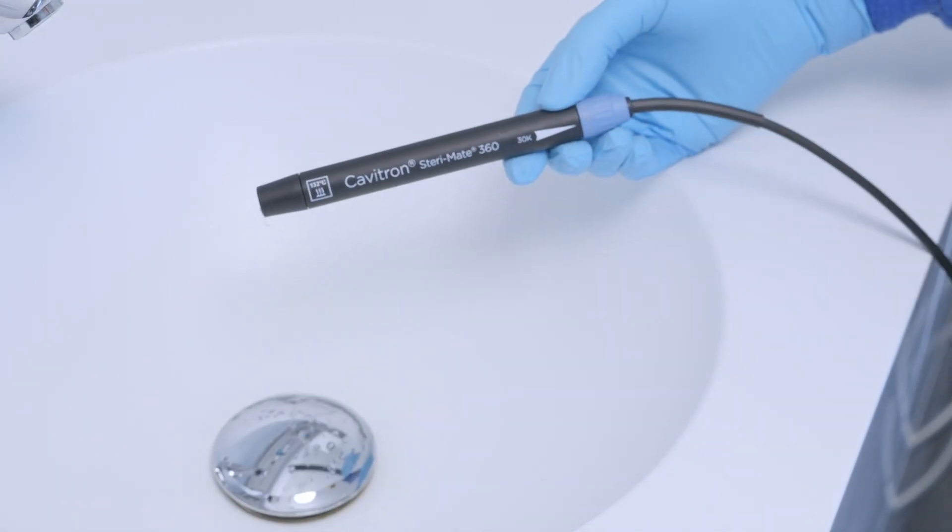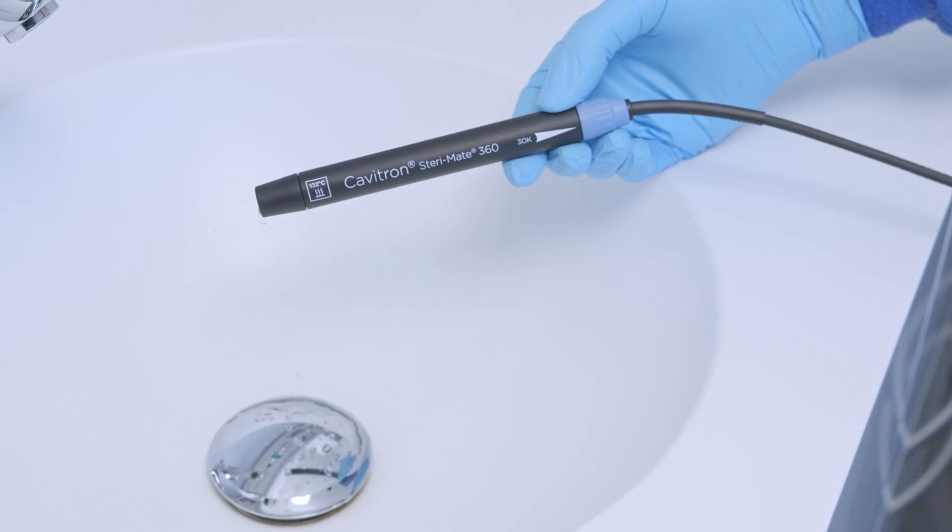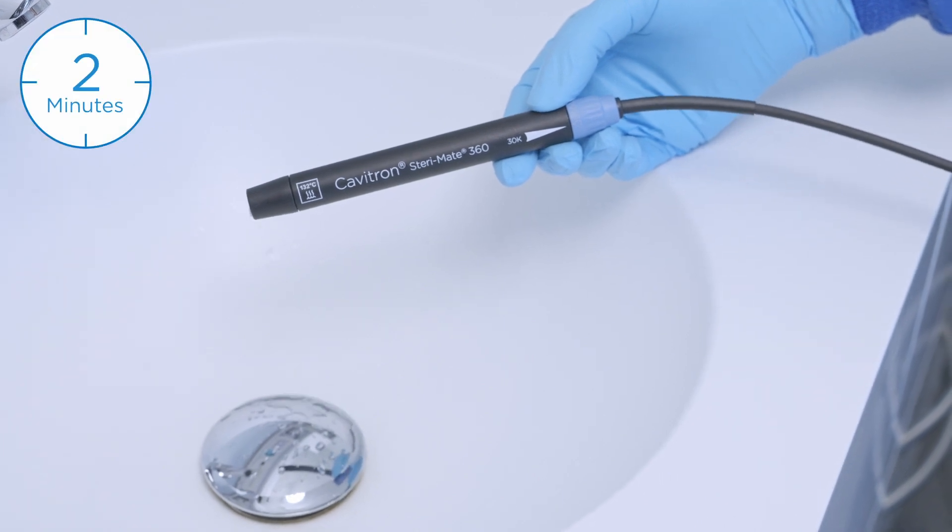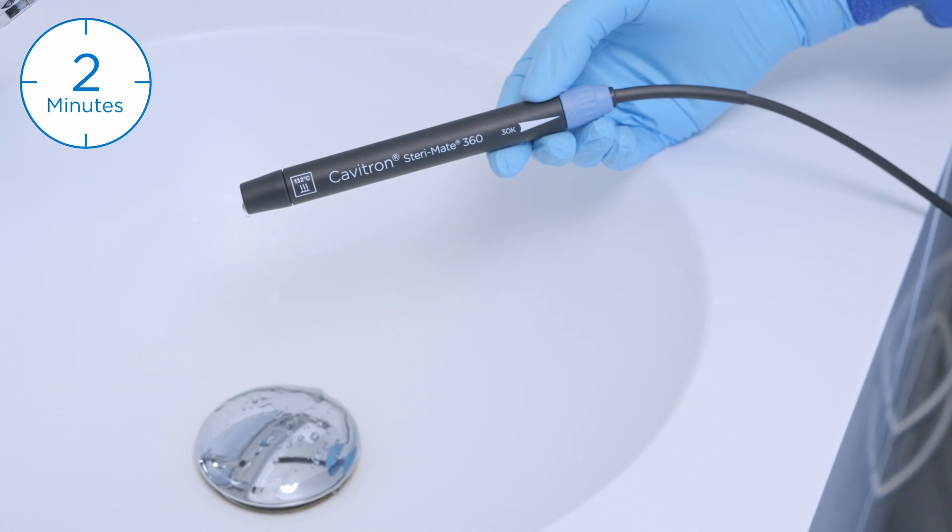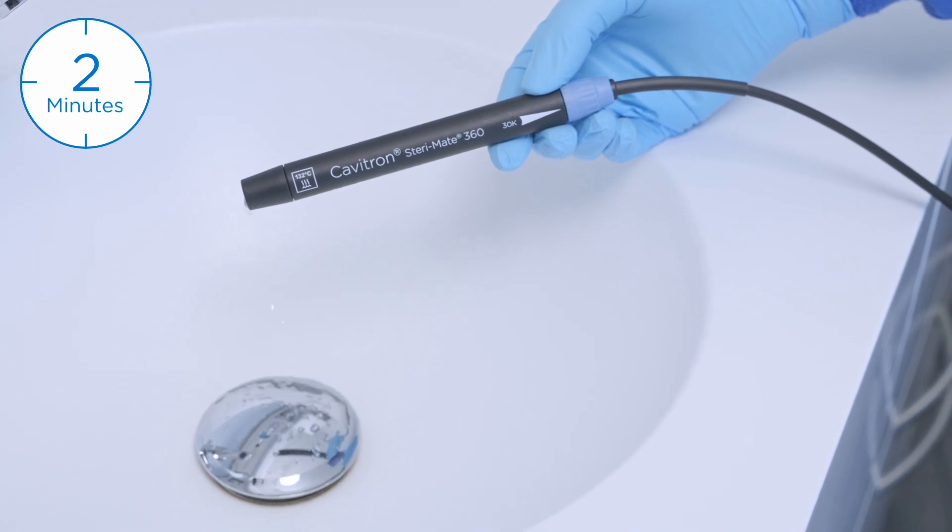Once again, operate the Cavitron system at maximum water flow for at least two minutes until all the water drains or all the sodium hypochlorite odor disappears.